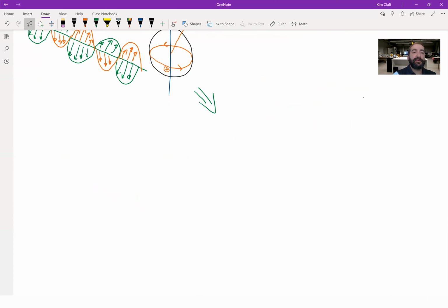And so let me show you what it looks like when that happens. So again, you have your hydrogen atom, which is spinning, in the presence of an external B field, and it's producing its magnetic moment that's precessing about the external B field.